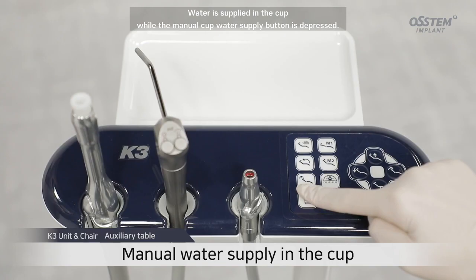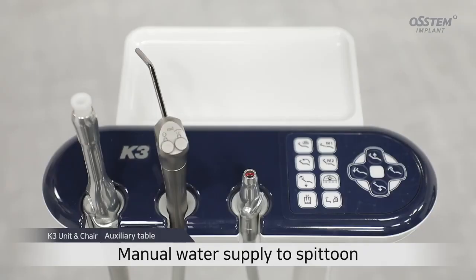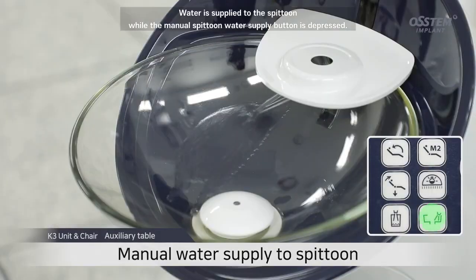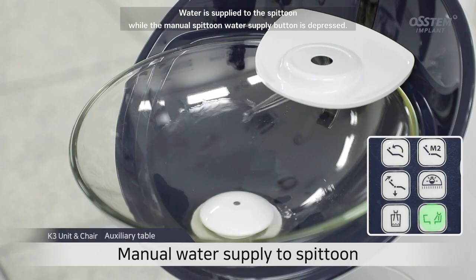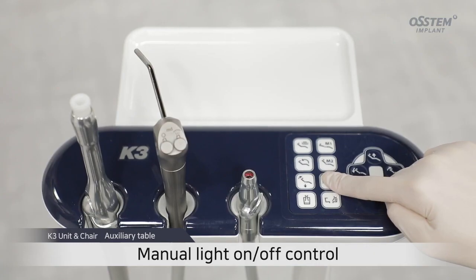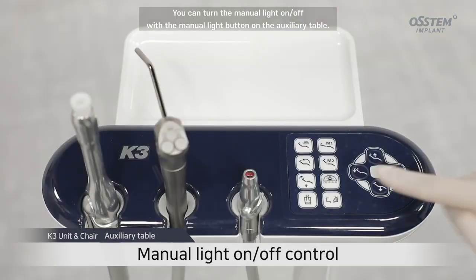Water is supplied in the cup while the manual cup water supply button is depressed. Water is supplied to the spittoon while the manual spittoon water supply button is depressed. You can turn the manual light on or off with the manual light button on the auxiliary table.